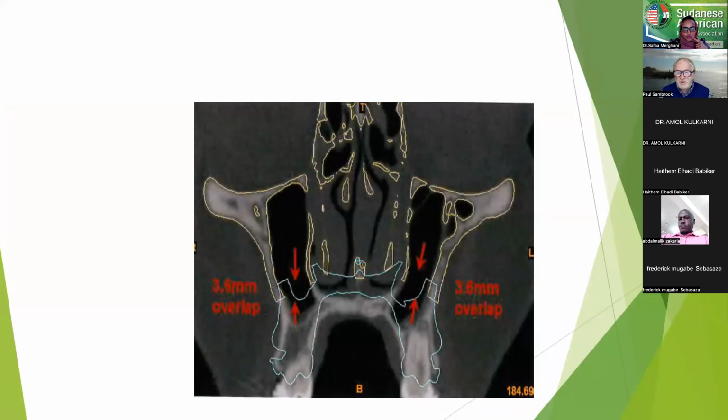And I need to really say that we still need to understand what sort of movements are required. This does not replace your surgical skill. You need to have a very good idea of what is possible in surgical planning and what is possible on the surgical table. If you don't, you will find yourself doing all sorts of things that are not possible within the theatre situation.